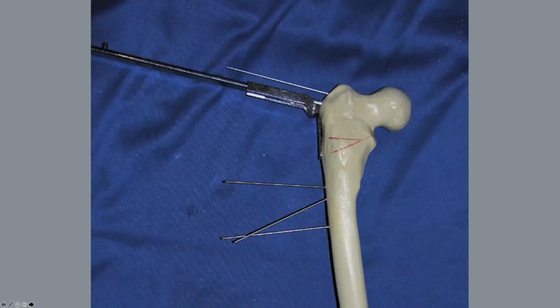The next thing you're going to do is start to put in this blade plate seating chisel, and you're going to tap this in increments. You don't want to just keep pounding it in because it will get stuck on you, and you will have a really difficult time trying to extricate it. And I can tell you this because I have done it, and it can be very hard. So work it in a little bit. You're trying to create a track that has memory. So you tap it in a little bit, back it up with the tuning fork, tap it back in a little bit, pull it back out with the tuning fork.